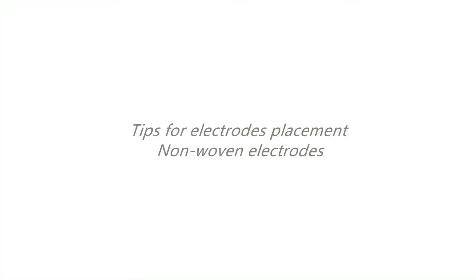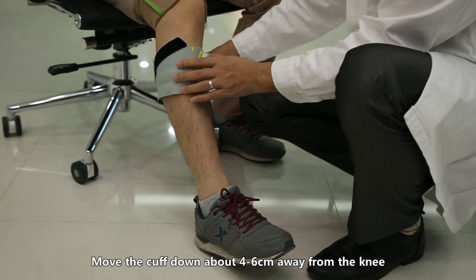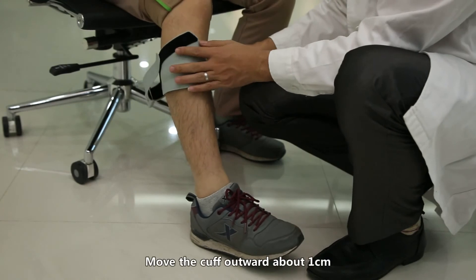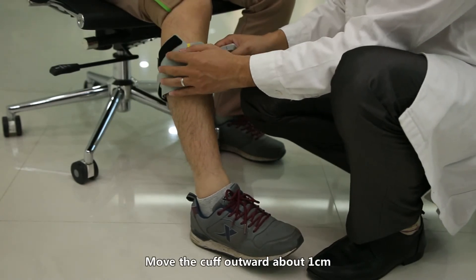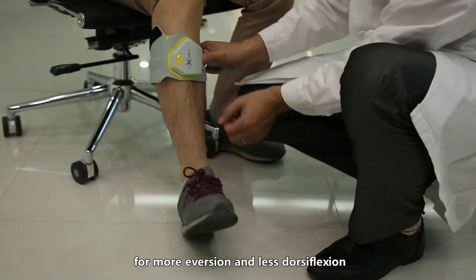Tips for electrode placement — non-woven electrodes. Move the cuff down about 4 to 6 centimeters away from the knee for more dorsiflexion and less eversion. Move the cuff outward about 1 centimeter for more eversion and less dorsiflexion.